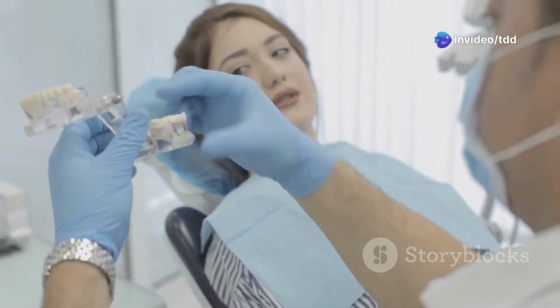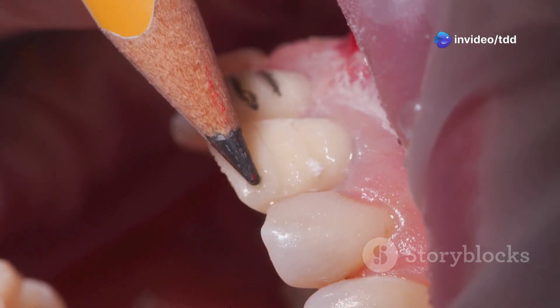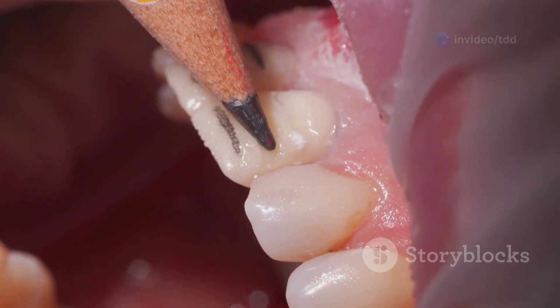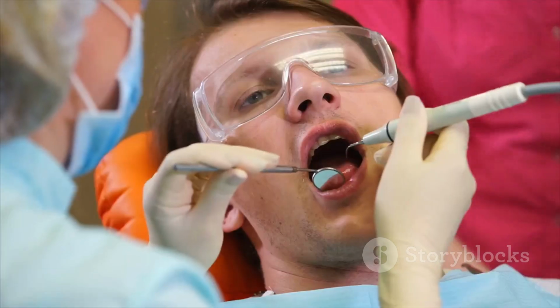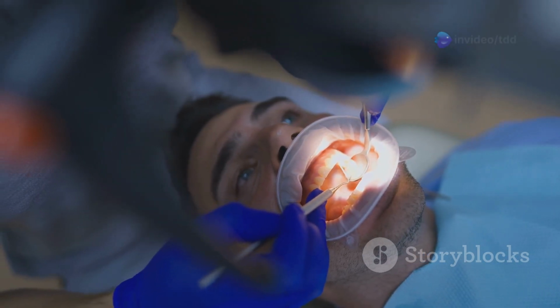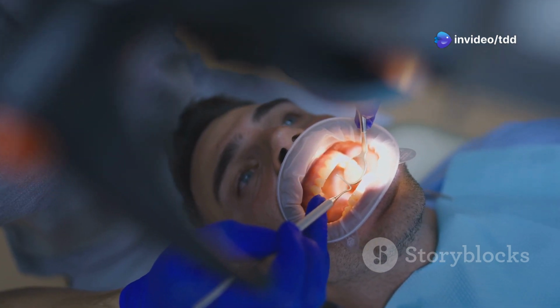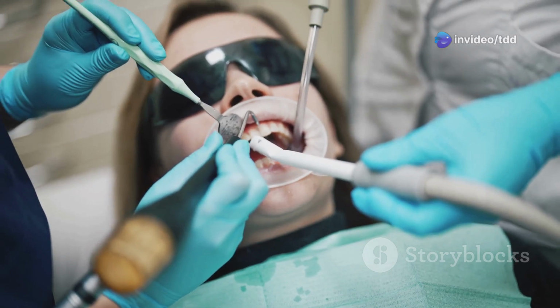Purpose: anesthetizes all teeth on one side, the lower lip and part of the tongue. Where to inject: near the mandibular foramen inside the pterygomandibular space. Landmark: palpate the coronoid notch. Insert the needle 6 to 10 millimeters above the occlusal plane, medial to the internal oblique ridge and lateral to the pterygomandibular raphe.